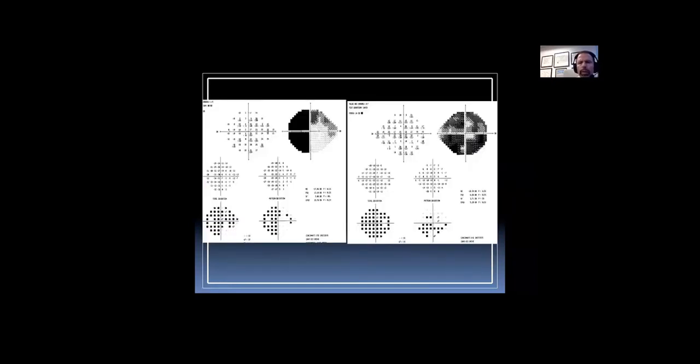So here's a visual field defect. And as I just said, the first thing you do when you look at the field, if you see one that has respect to the vertical midline, and clearly this one has respect, it crosses a little bit here, but there are many steps across this midline where when you look at the numbers, you can see the numbers are all zeros or very close to zero. So there's a big step across the vertical midline. You look at the other eye and say, whoa, wait a minute. Could that be a step maybe? I don't really see any really obvious steps. This field just looks sort of generally crummy.